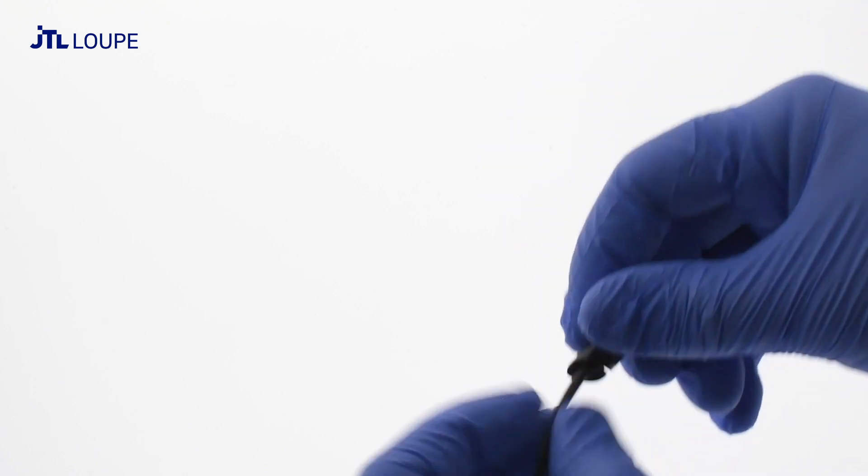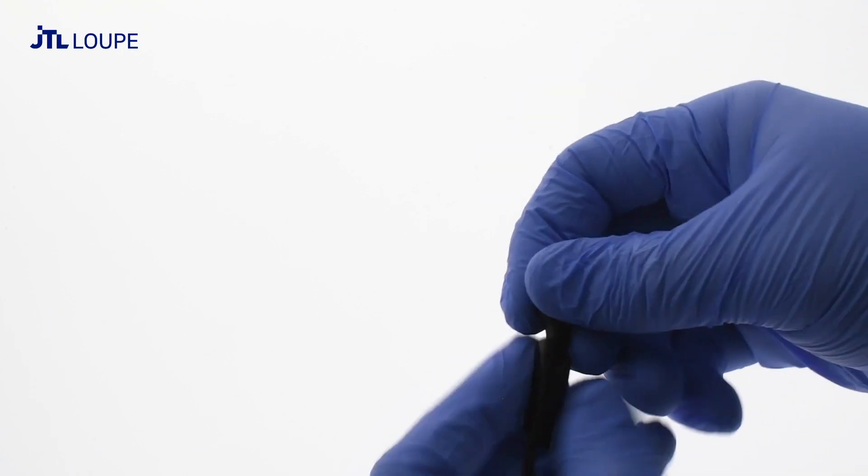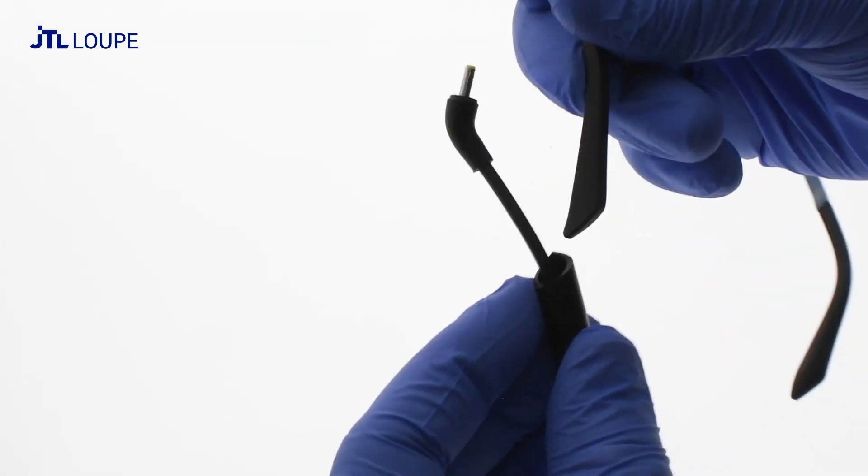Begin by attaching the wire to one of your temple arms. Feed the wire through the spiral, then slide the spiral onto the temple arm.